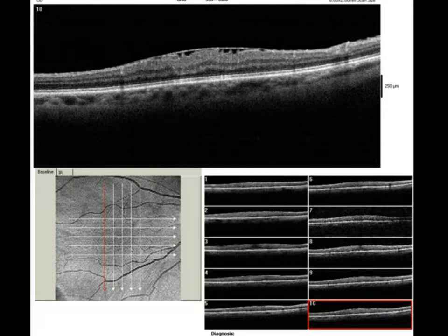And it explains why that patient's visual acuity is reduced. Normally for epiretinal membranes, we're not really referring for treatment unless it's at 20/40 or worse, and that's when we start having those more serious conversations with those patients about a true epiretinal membrane peel. With vitreomacular traction, we are certainly managing these patients differently because, again, now we're seeing what's happening and going on in the retina.